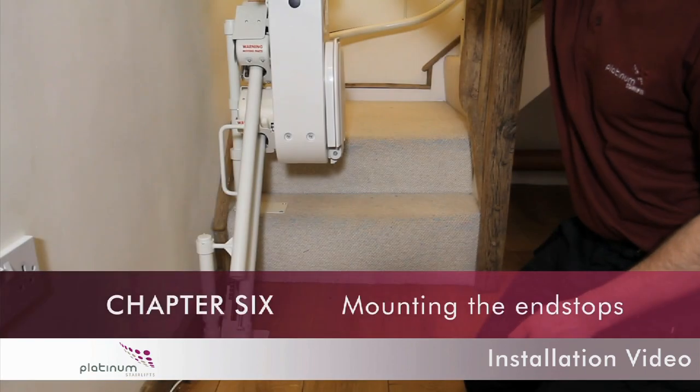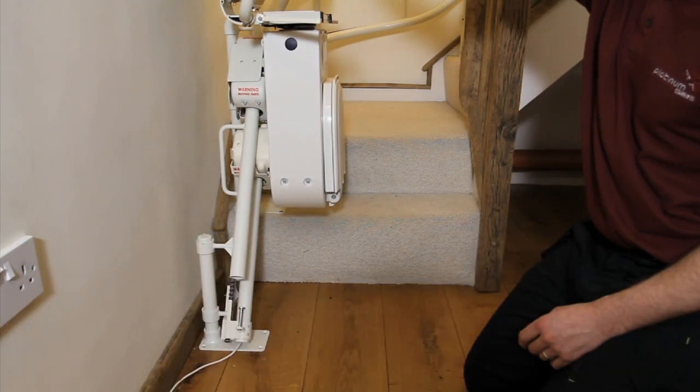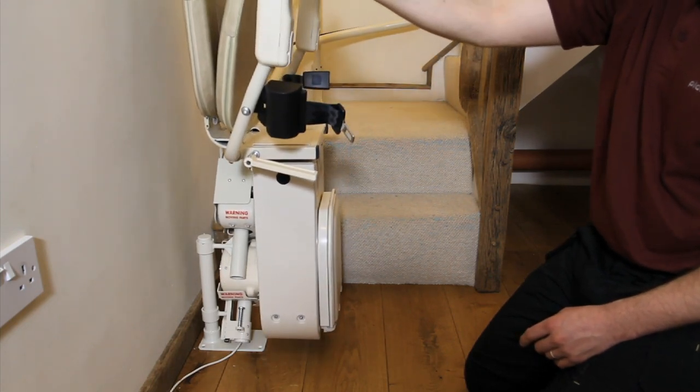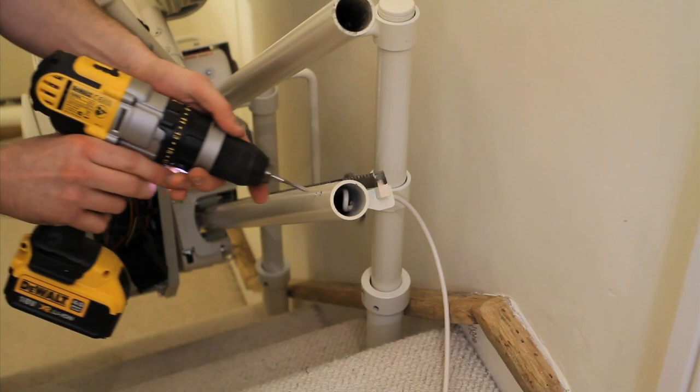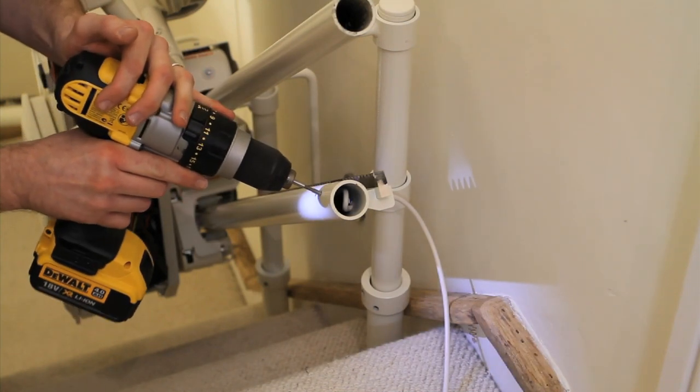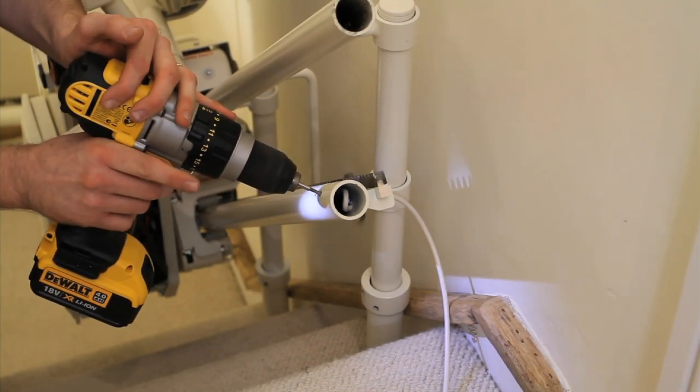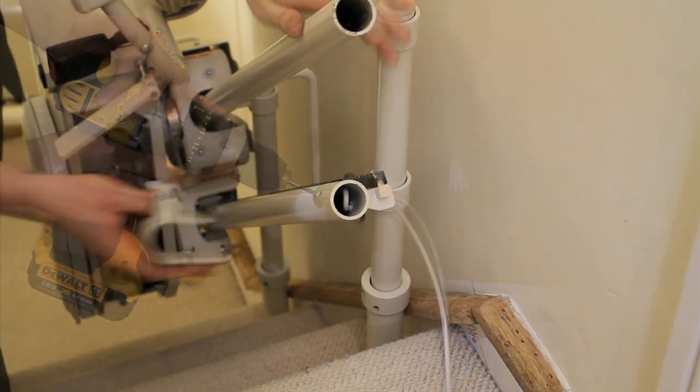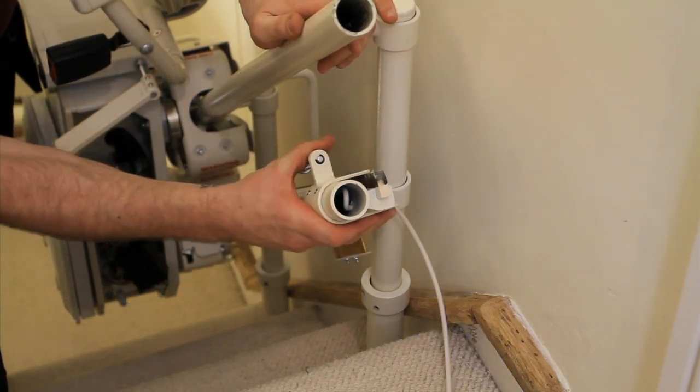Chapter 6: Mounting the end stops. Before mounting the end stops, move the carriage to each end of the rail to determine the end stop positions at both the bottom and top of the rail. Once you are happy with your end stop positioning, drill the bottom tube for each end stop, ensuring NOT to drill through the charging cable and fix them both into place.